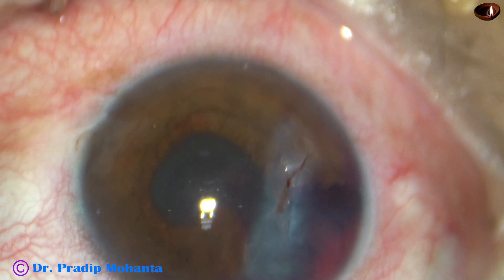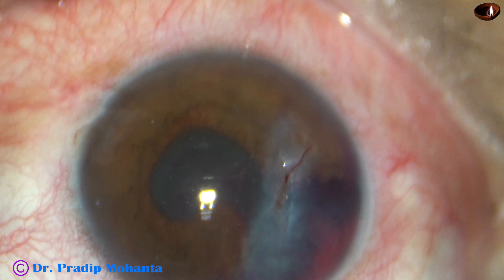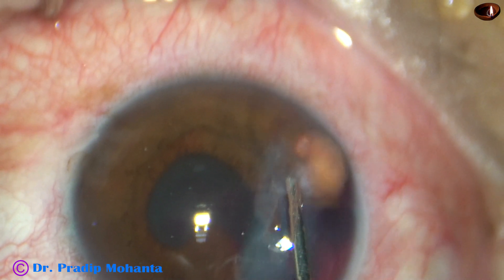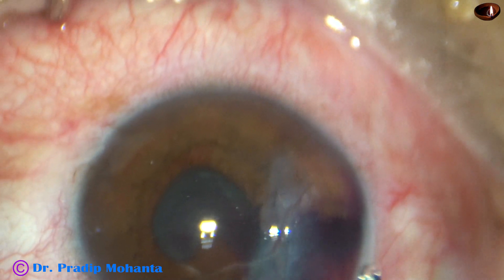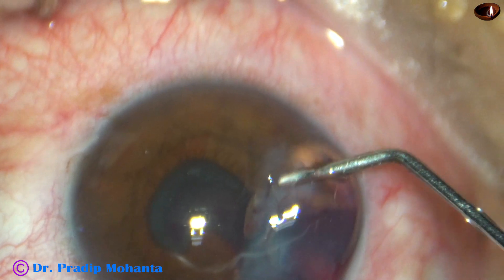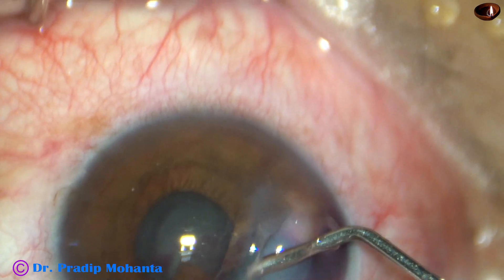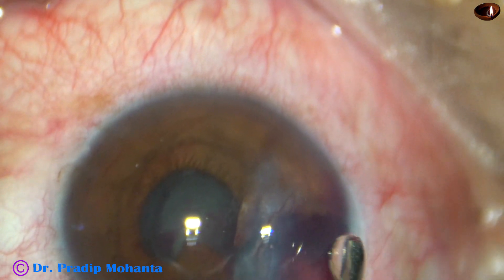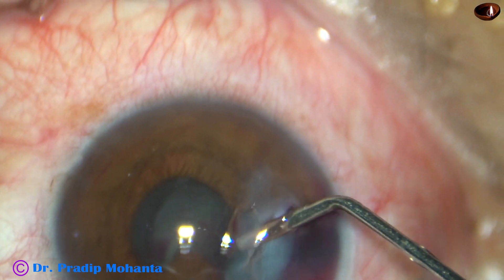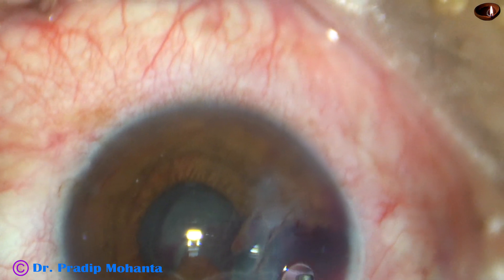So I have asked for Visco, 2% HPMC. I want to push the iris down so that this iris is not entangled in the bites of the 10-0 nylon that I am going to use shortly. So this is 2% HPMC, and the iris has been pushed back.